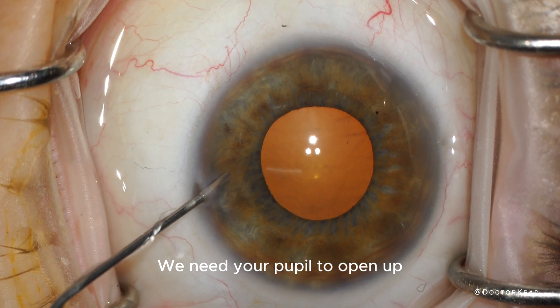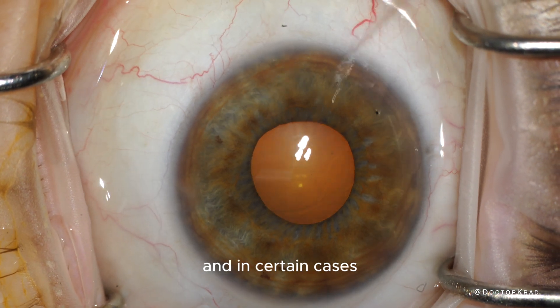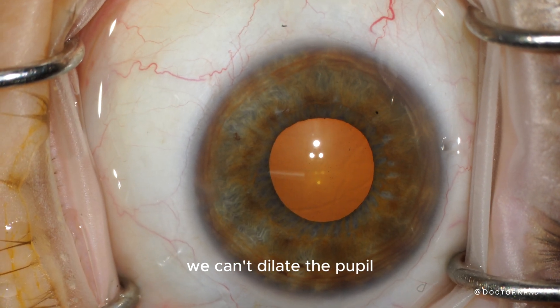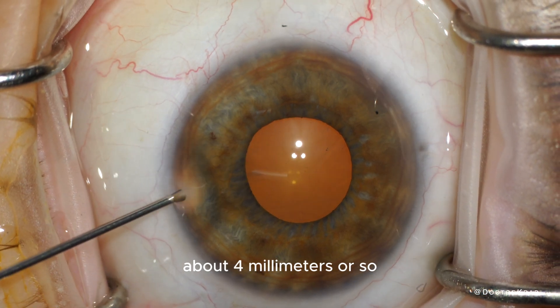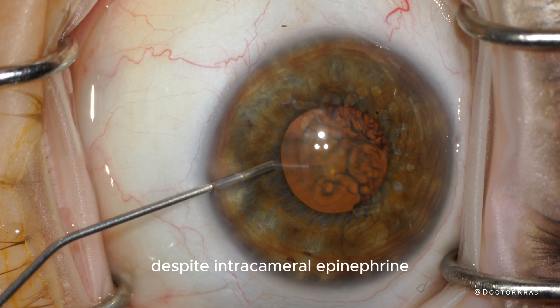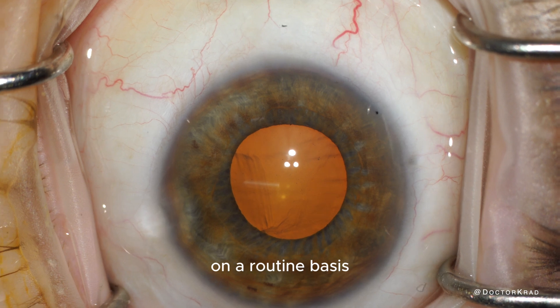We need your pupil to open up and dilate so that we have access to the cataract. In certain cases, we can't dilate the pupil. This pupil here is no larger than about four millimeters, despite intracameral epinephrine. So I'm going to show you how I deal with it on a routine basis.